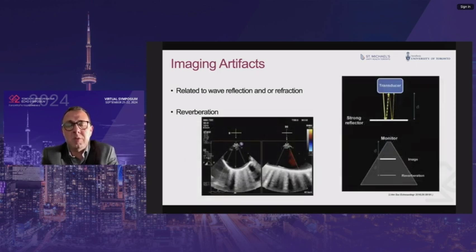This patient came from home for an outside echo, for a follow-up for another disease, and on the descending aorta this kind of structure was seen that could be related to a type A dissection. Of course, the clinical context: the patient had nothing, was not symptomatic. And as you can see, one tip to identify that this is an artifact is that with color, the reverberation doesn't change anything in terms of the color flow.